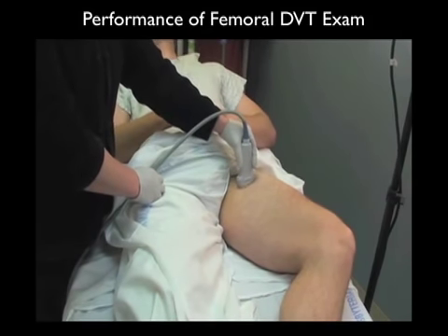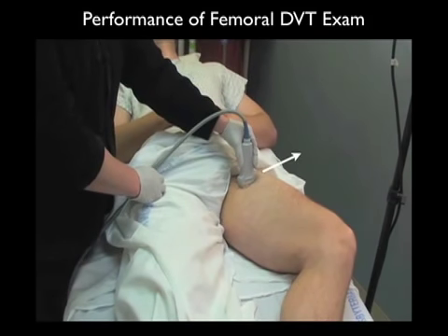Now a clot will not completely compress with pressure down with the probe and thus will be identified on bedside examination. Notice here, it's standard to have the marker on the probe going lateral so that we know where we are with regard to the orientation of the probe versus the screen.